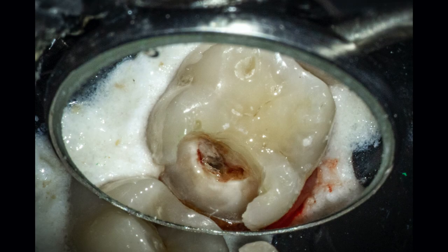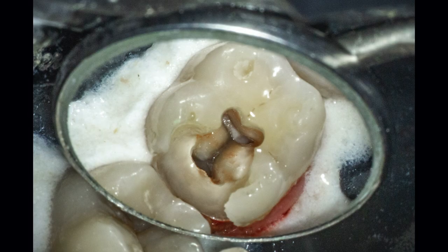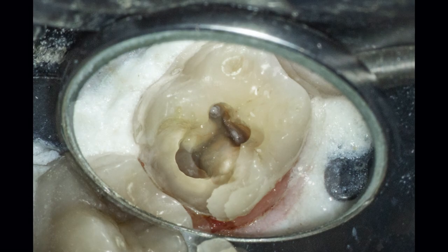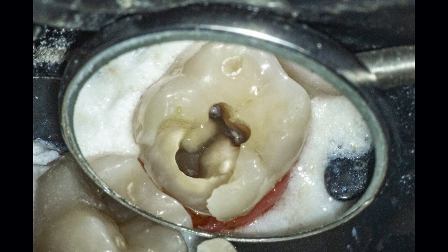Once the field is under control, I can now create my ideal access. The damage here to the distal will certainly affect my irrigation protocol, so I'm going to take the time and rebuild that wall with the pre-endodontic buildup.